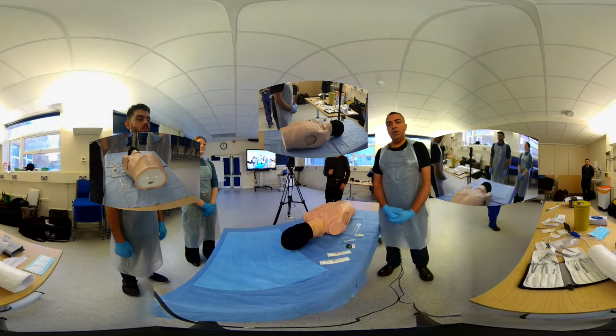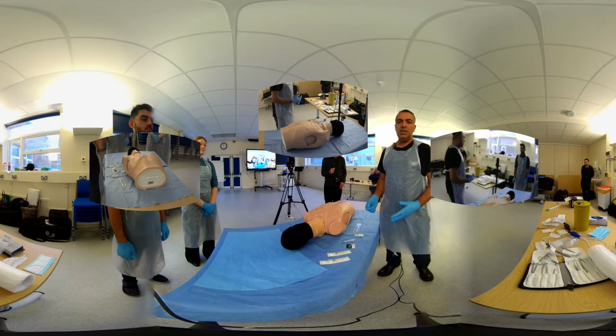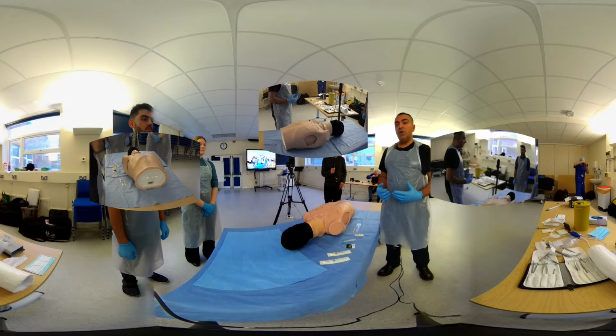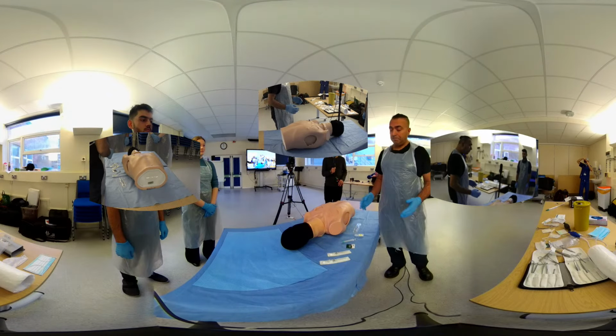Hello, I'm going to be describing simulation of needle thoracentesis for the emergency management of a patient who we've already determined has a tension pneumothorax. So it's an emergency situation. Tension pneumothorax is obviously life-threatening.